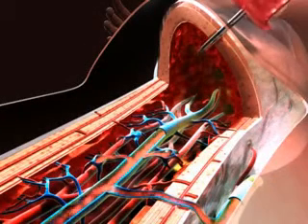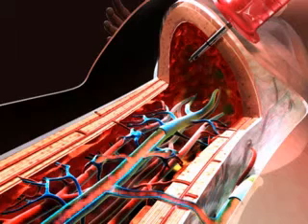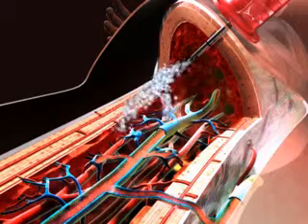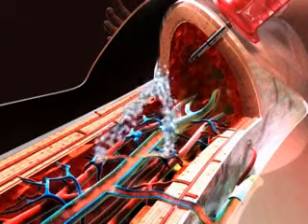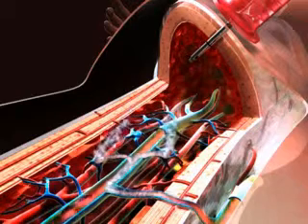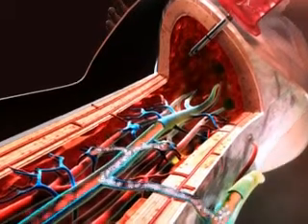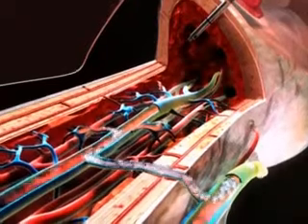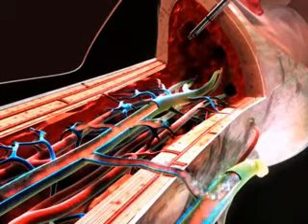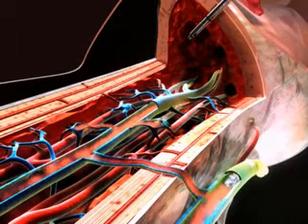The medullary cavity is a highly vascular structure that functions as a non-collapsible vein, capable of accepting a large volume of fluids and medications and rapidly delivering them to the central circulation. The medullary venous sinusoids drain into a central venous channel, which exits the bone in the form of emissary and nutrient veins. The rate of infusion is limited by the size of the medullary cavity and the diameter of the intraosseous needle.